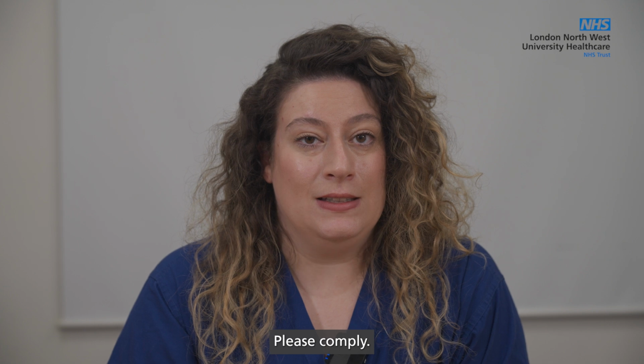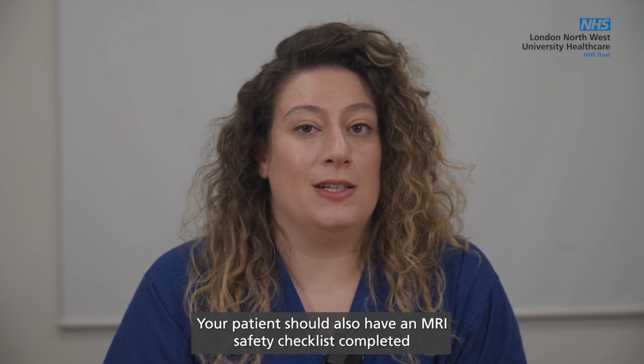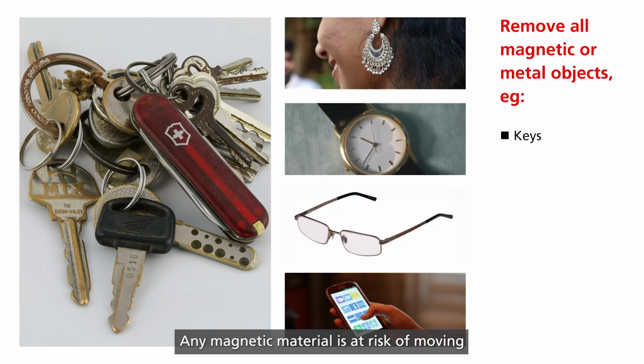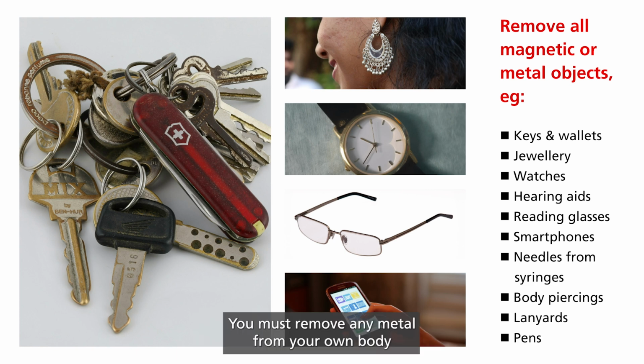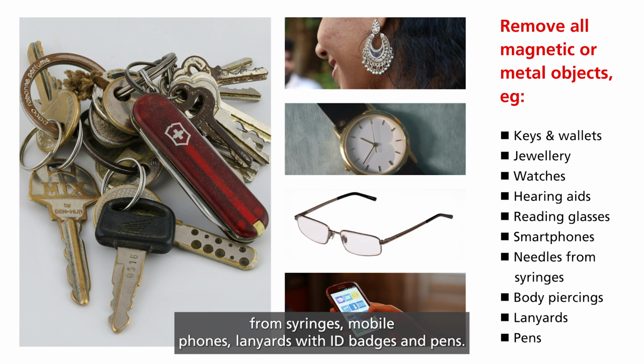Please comply. Your patient should also have an MRI safety checklist completed ahead of time and checked by the MRI team prior to the transfer. Any magnetic material is at risk of moving at a very fast speed with the potential for fatal accidents. You must remove any metal from your own body and your patient's body ahead of time, including jewelry, needles from syringes, mobile phones, lanyards with ID badges, and pens.